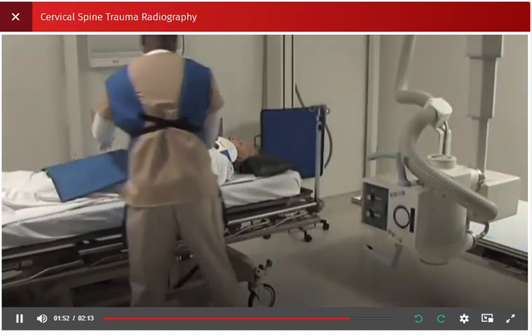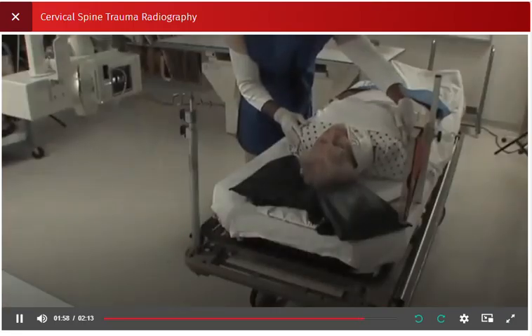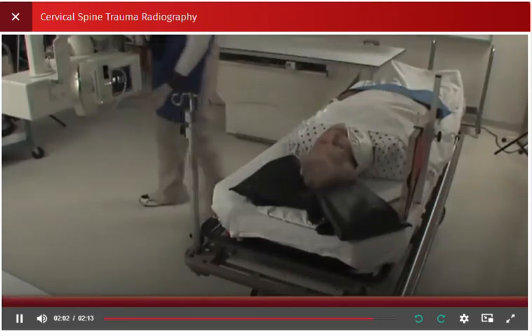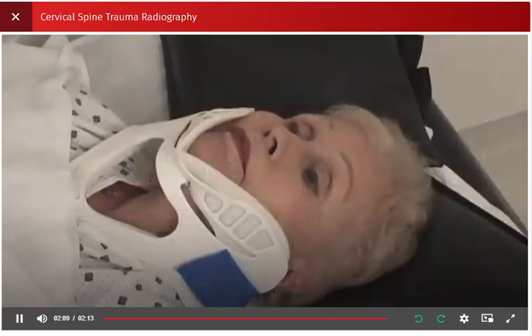Shield the patient and give the patient instructions on what will occur next. Give appropriate breathing instructions and have the patient suspend respiration on full expiration to help depress the shoulders. Remove the image receptor and inform the patient that the image will be processed and available for the emergency room physician to view.